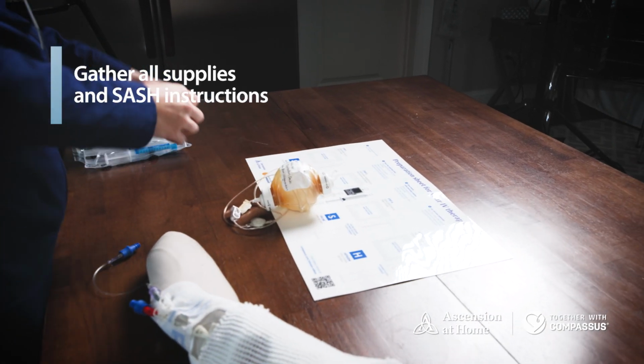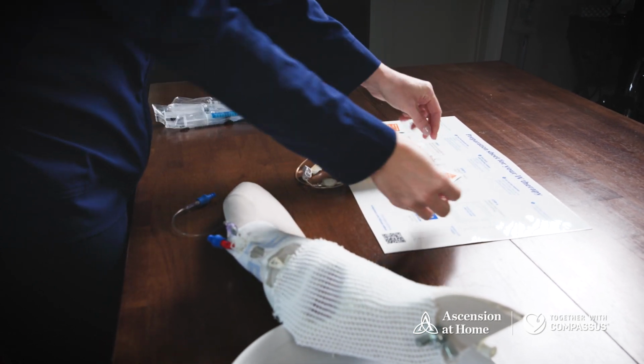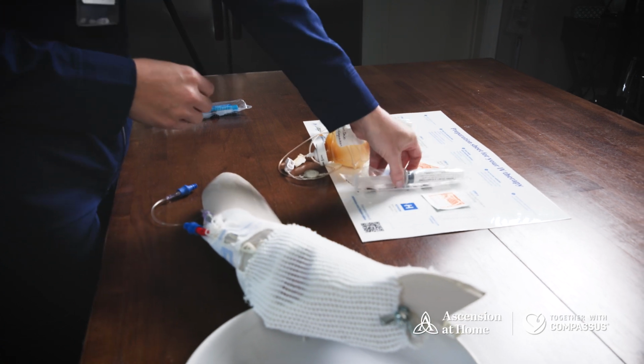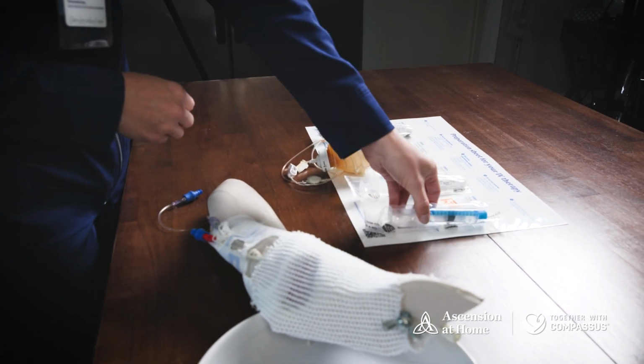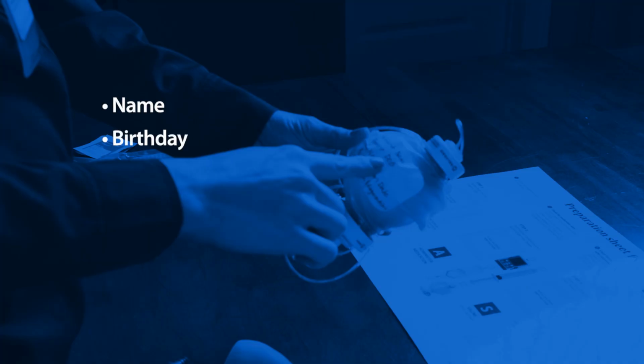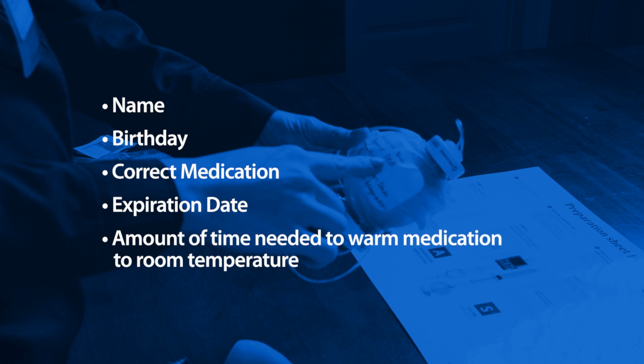Gather your supplies and SASH instructions. Your IV medication elastomeric pump, 2 saline syringes, 1 heparin syringe, and 4 alcohol wipes. Check the medication label for your name, birthday, correct medication, expiration date, and amount of time needed to remove the medication from the refrigerator to warm the medication to room temperature.